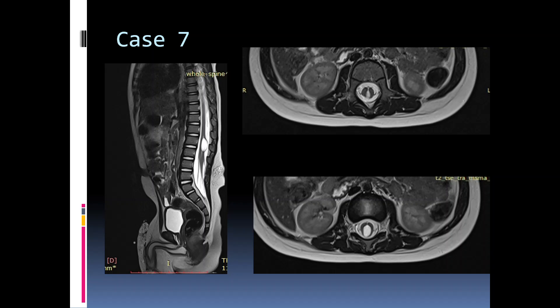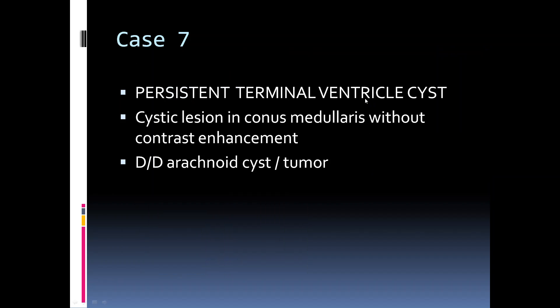Spine MRI of this five-year-old child shows an abnormality in the region of the conus medullaris. There is a well-defined cystic lesion communicating with the central canal, and on the axial images the communication is well visualized. This is a case of persistent terminal ventricle cyst; the differential is arachnoid cyst or tumor, but absence of enhancement helps differentiate from tumor, and an arachnoid cyst is generally eccentric and will not show communication with the central canal.